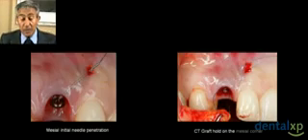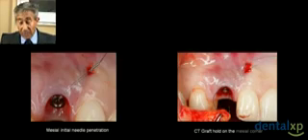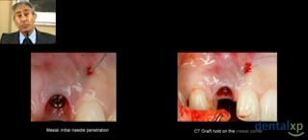The connective tissue graft is harvested, and we keep all tissue. There is no need, in fact, to remove the fat tissue from that graft. The thicker it is, the better it is. Now, it is important to understand that we want this full, important graft to be inside that pouch.